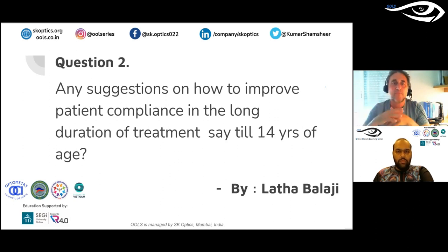This is the cases. After this, some children want to keep the treatment and you need to convince them to continue. One thing I do when the child is around 17 or 18 years old, for sure, they get the driving license. At the moment they get the driver license, at 18 years old, the myopia is not growing as fast as before, and I will change the lens to a larger, normal treatment zone diameter so they get the best quality of vision, and they will continue to control myopia somehow.